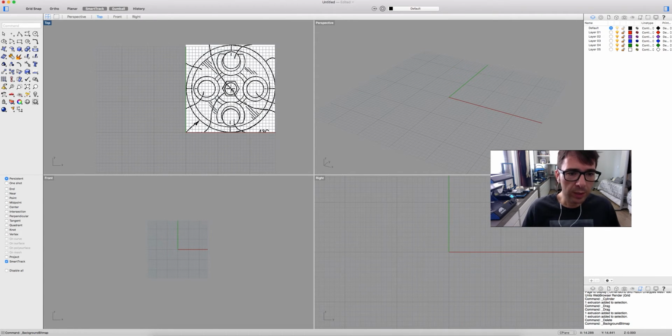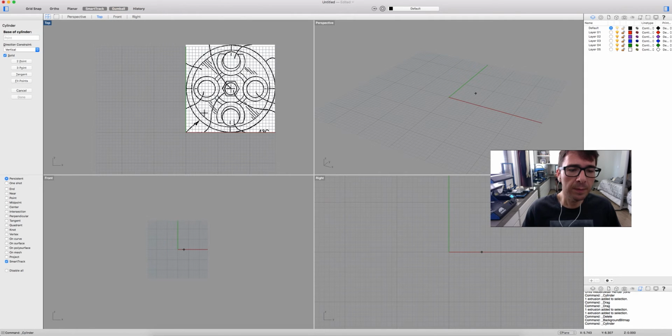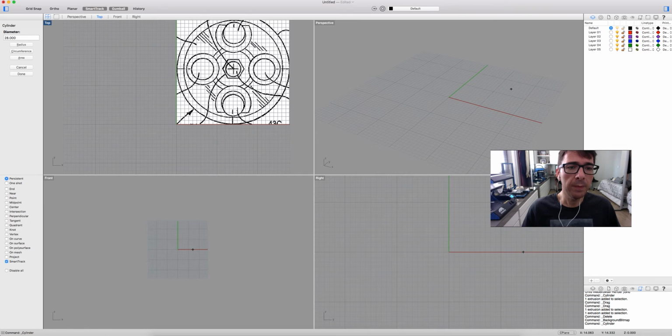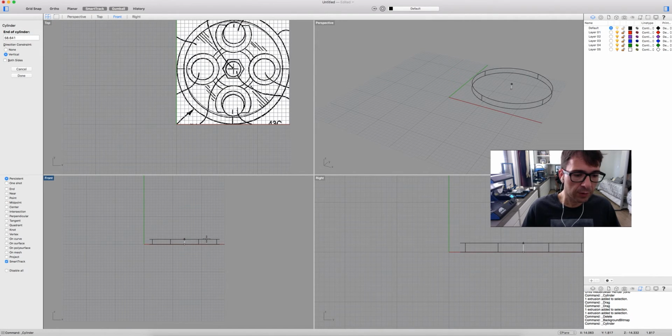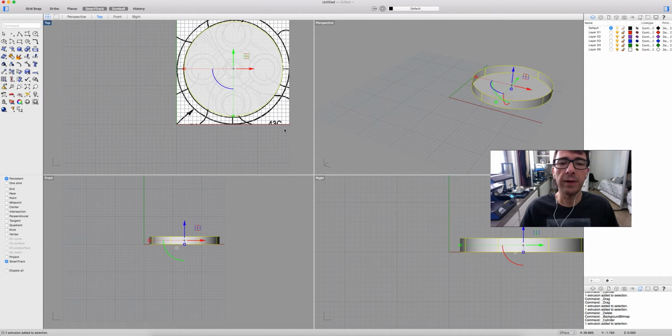So we know this is the central pin guide, solid, cylinder. Let's use the image as reference here. We can use the image, or we can do the radius just as we did the other way. We are going to choose right here, and the offset here in the front view. Okay, now we have a base plate.